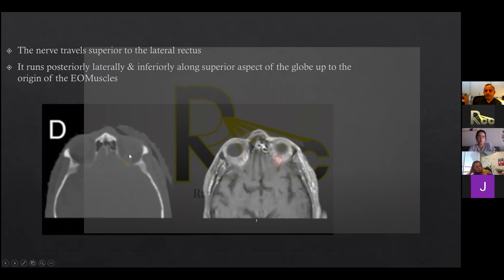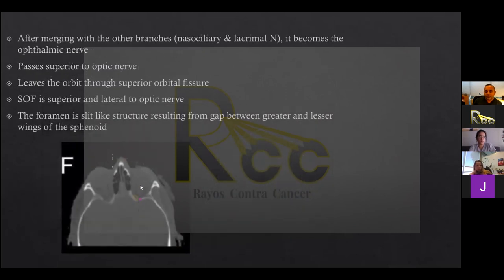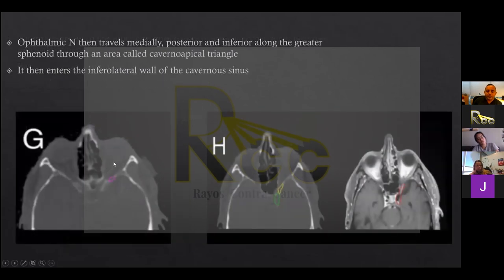And then here you're looking at the lateral rectus muscle, and the superior orbital fissure is going to lie right up here. So here you can see, again, here's that optic nerve, here's the globe, and then here's that superior orbital fissure right here. So when you're treating these patients, basically your volumes are going to look something like this. If I were to take my brush and draw, you're going to cover all this area. So you're going to cover the posterior aspect of the retina. You're going to cover the optic nerve because you can see here's the optic canal right there. And then here's the superior orbital fissure right next to it, right lateral to it. So it's very hard to miss the nerve if you're going to treat this nerve path.